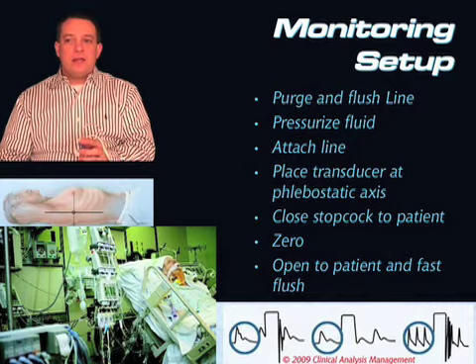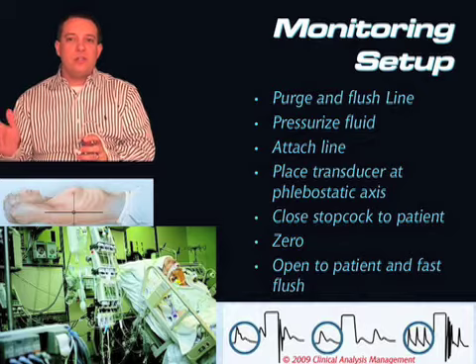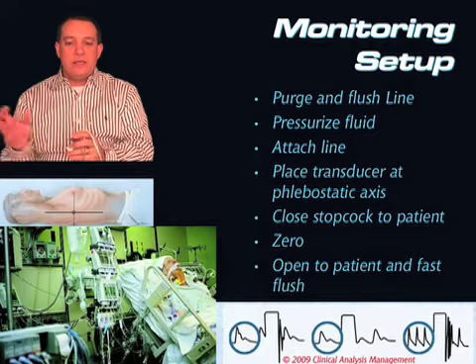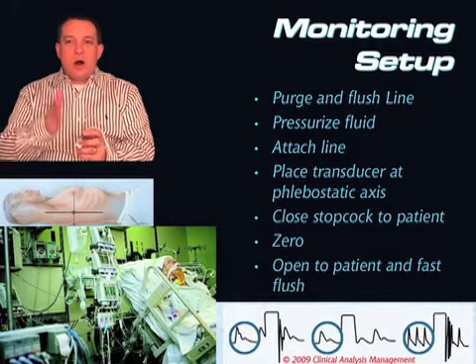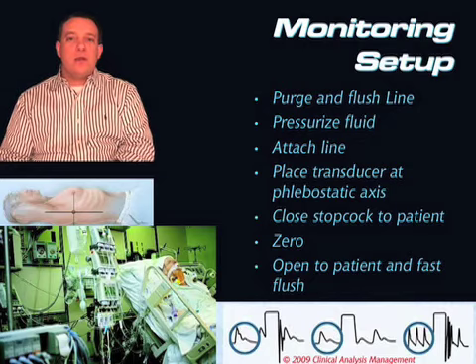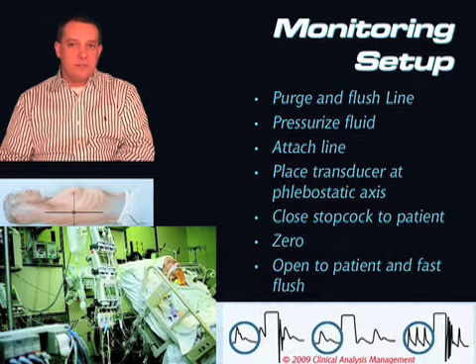Finally, when we look at the last waveform set, the one all the way over to your right, when we release the pigtail, we see all these little bounces before we go back into a waveform. That is called an underdamped system. Underdamped systems are problematic as well as overdamped systems. So we don't want the system to be overdamped, and we don't want it to be underdamped.